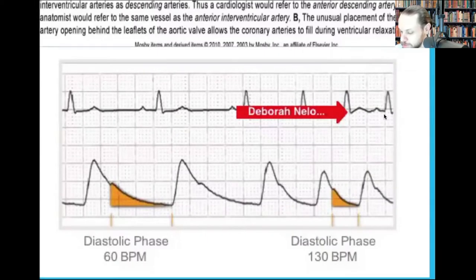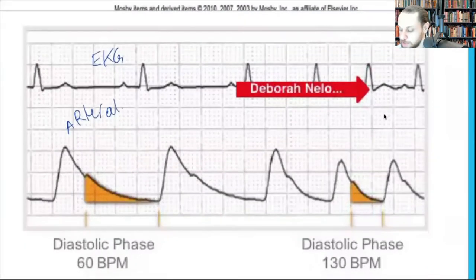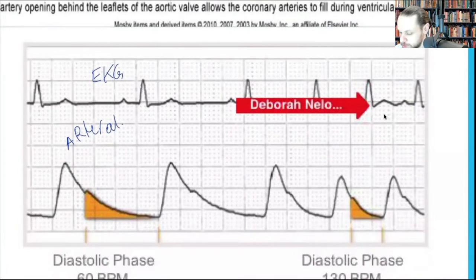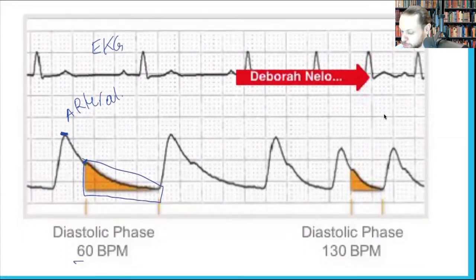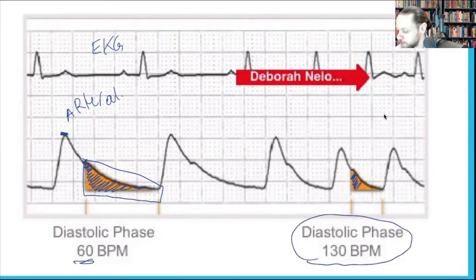This is the EKG at the top and this is your arterial waveform. The waveform shows systole, where diastole starts, and the diastolic phase. At a heart rate of 60 beats per minute, look at how much time is spent in diastole — versus when the heart rate becomes 130.